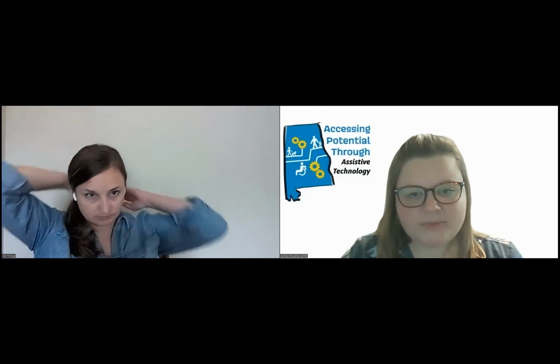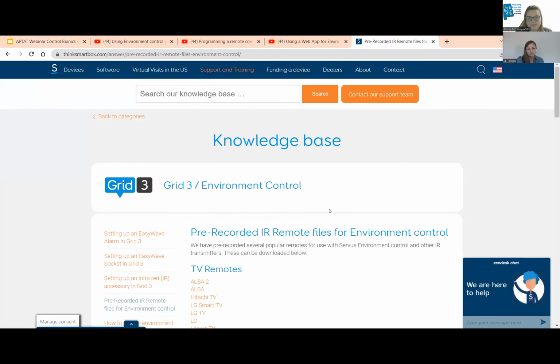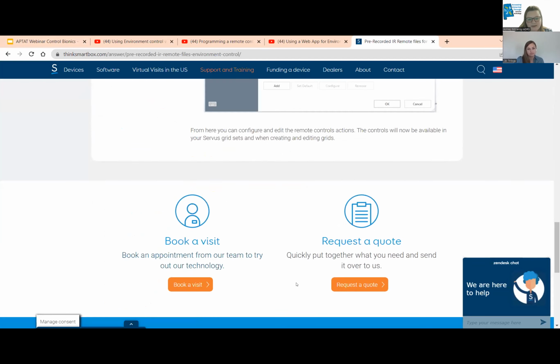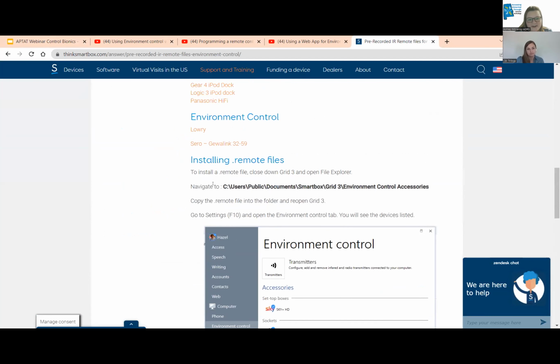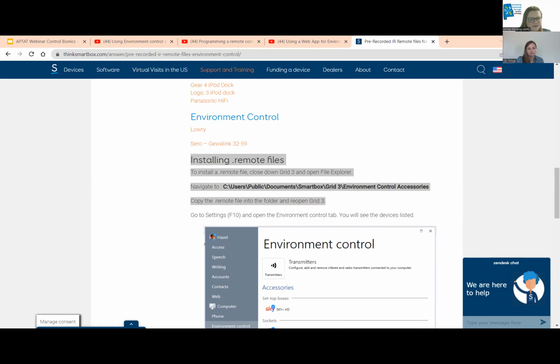Let me show you this, which we learned, which was pretty cool. If you go to thinksmartbox.com and you find their pre-recorded IR remote files, you should be able to download these. I'm going to show you real quick because I didn't show this in the video I'm about to show you. You want to make sure that it's installed to the right location on the device. I don't have any sound for this one, so we should be good.